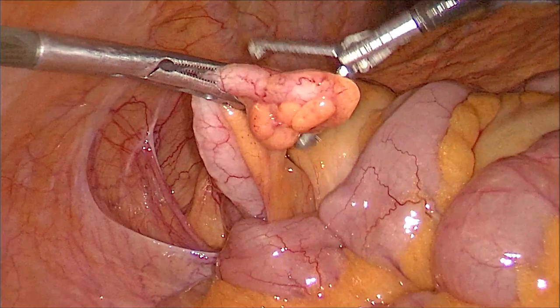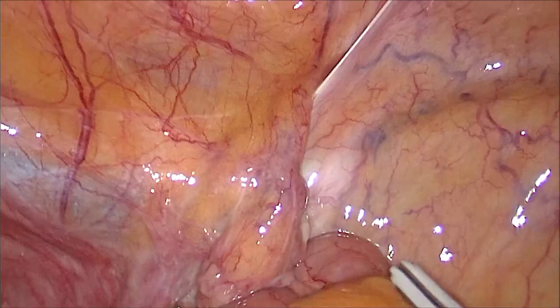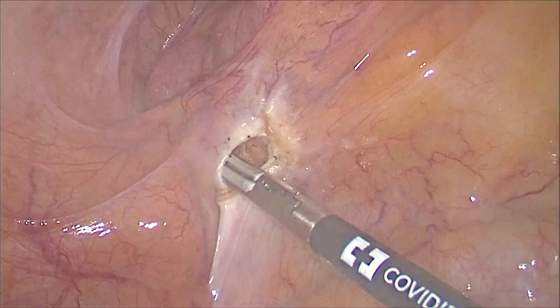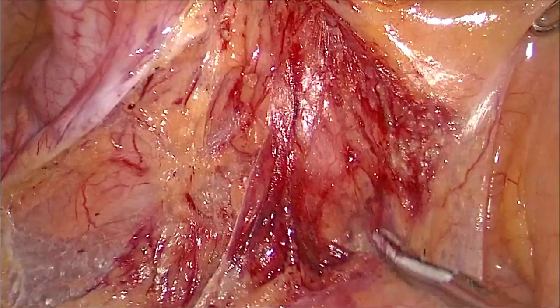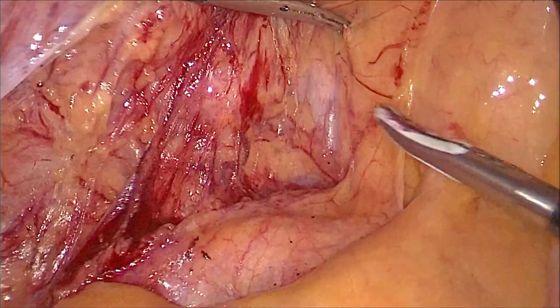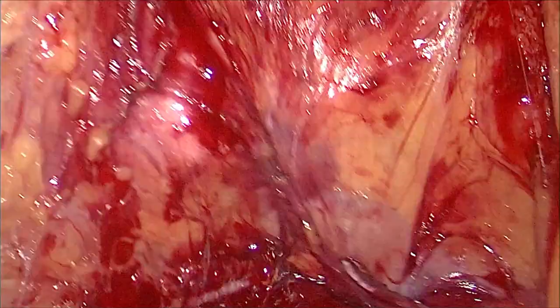The appendix is held and pulled cranially and towards the left so as to expose the ileocecal region. We are able to identify the right ureter with its peristalsis. What we follow is a medial to lateral approach. There are different ways of doing this; we depict here an approach called the initial retroperitoneal endoscopic tunneling approach, in which the right colon is mobilized from a caudal to cranial direction except for its lateral attachments, to free it from its posterior attachments with the retroperitoneum. Once we enter the correct plane it is almost bloodless.